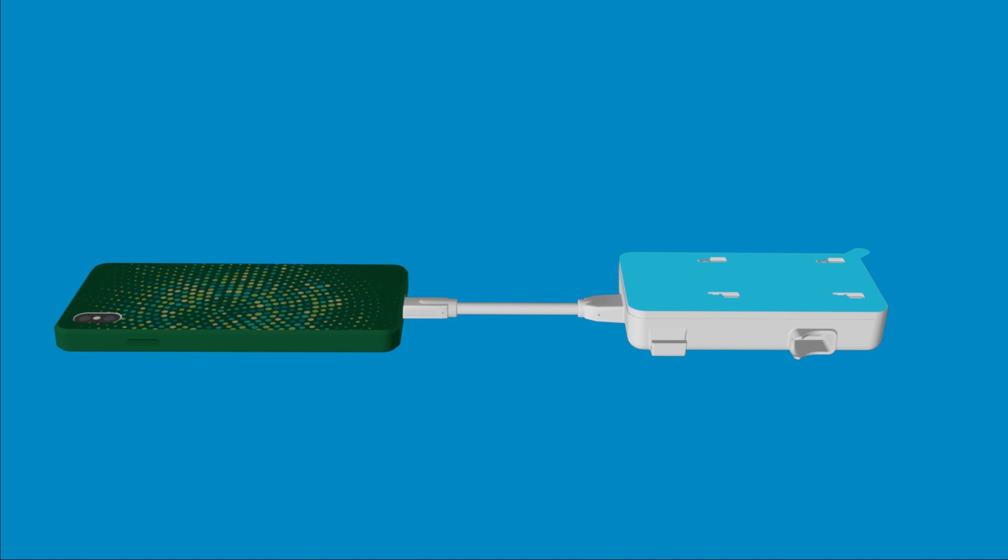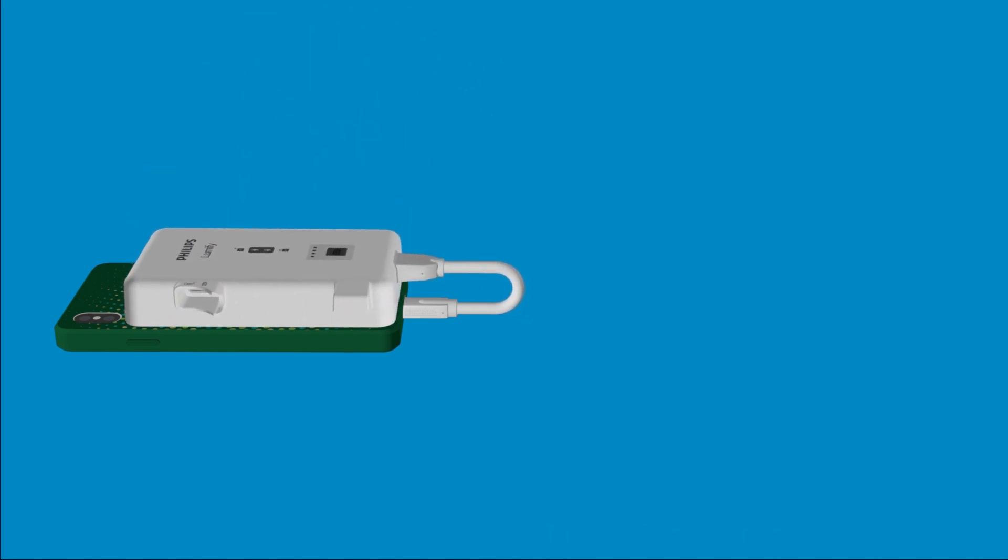Now, carefully peel off the blue adhesive cover from the mounting plate by grabbing the tab in the top corner. Make sure the back of your device case is clean and attach the exposed adhesive to the case with the flexible cable still attached. Press firmly to ensure the adhesive makes a good connection with the back of the device case.